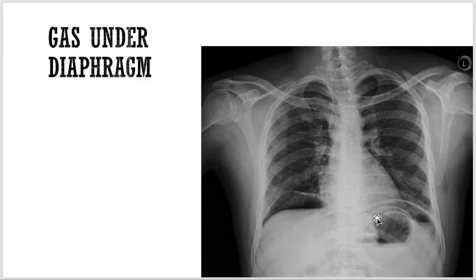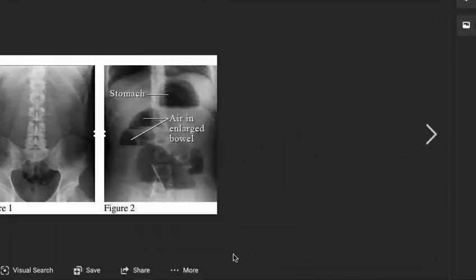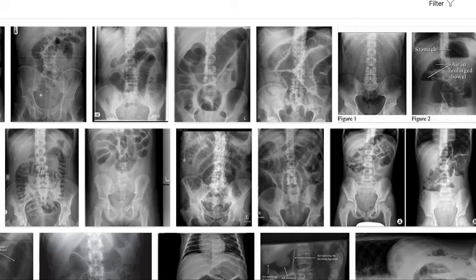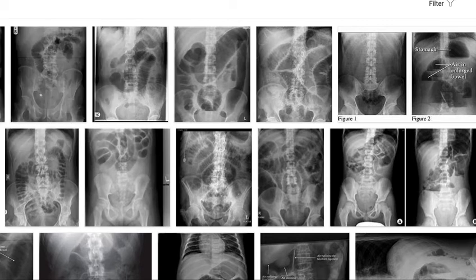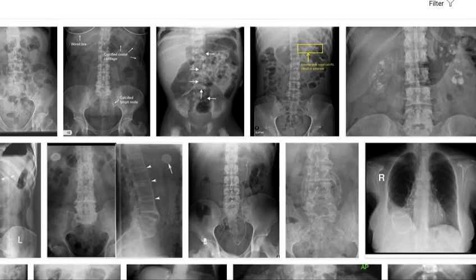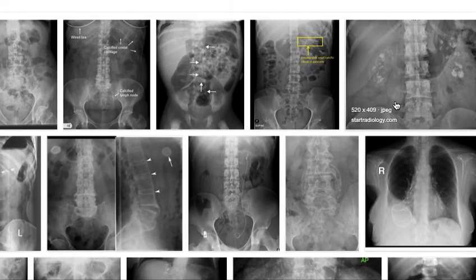Okay, and the whitish areas in this one, sometimes we see too much whitish area. Basically that occurs due to calcification. Now you can see over here too much whitish area, or I want to show you some clear. Yes, this one.